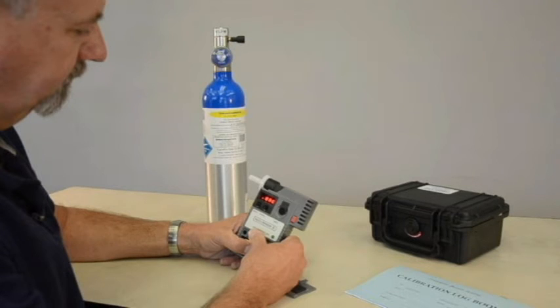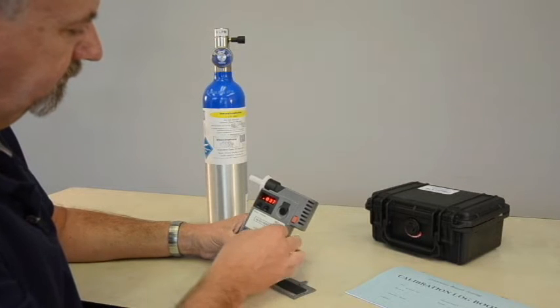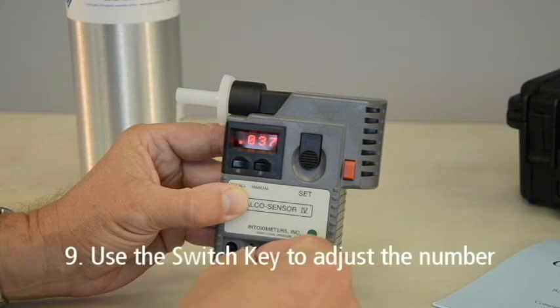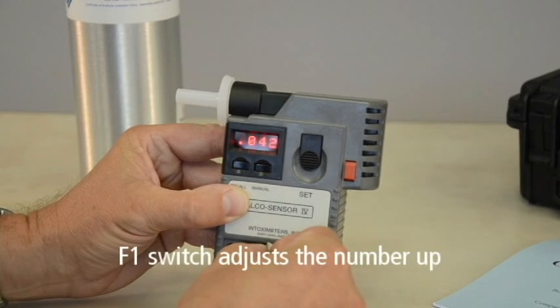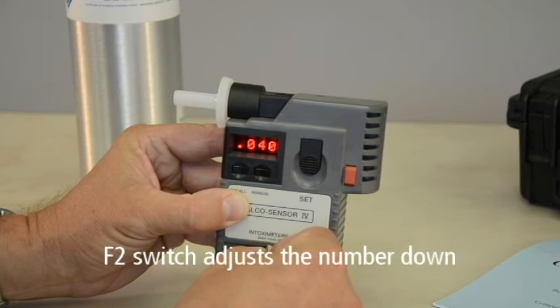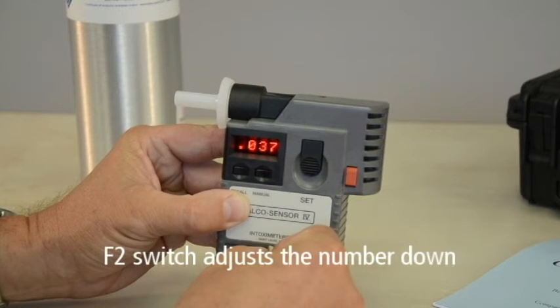If the expected value of the gas standard being used for the current calibration is different than the value of the last calibration displayed on the screen, use the switch keys to adjust the number. The F1 switch will adjust the number up. The F2 switch will adjust the number down.